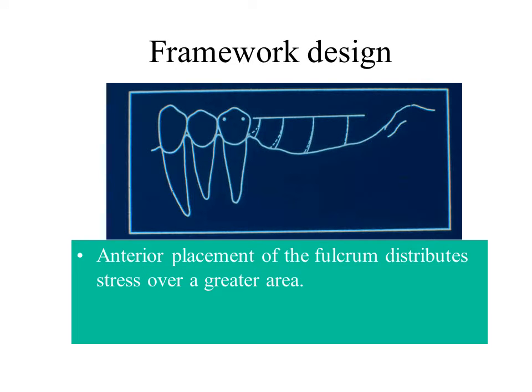Framework design is an important consideration. Support from the ridge increases with the length of the span. The illustration shows the influence of mesial rest placement on the force distribution across the length of the ridge. In addition, rigidity of the components is essential for force distribution.